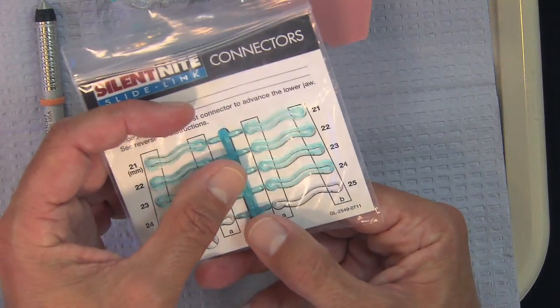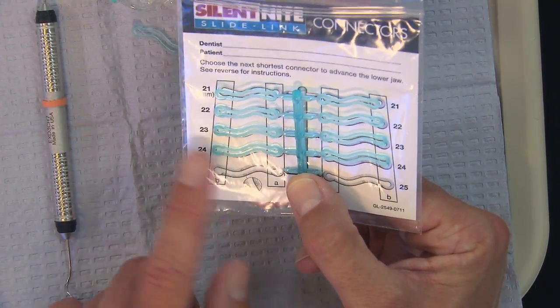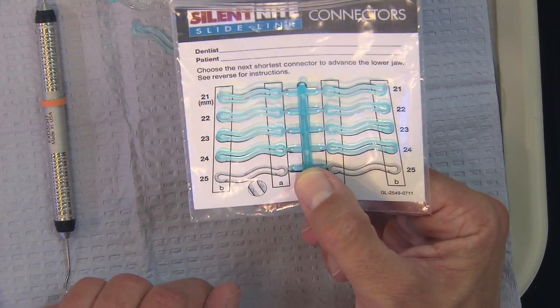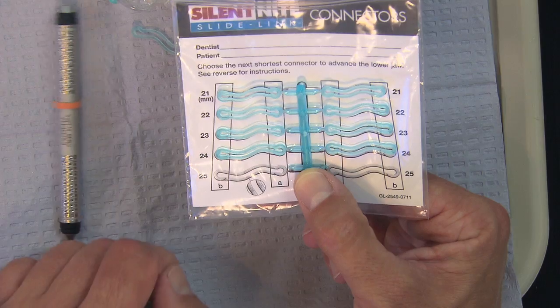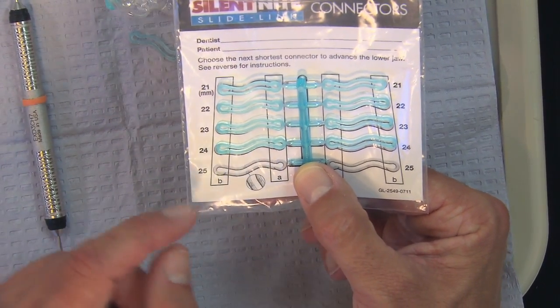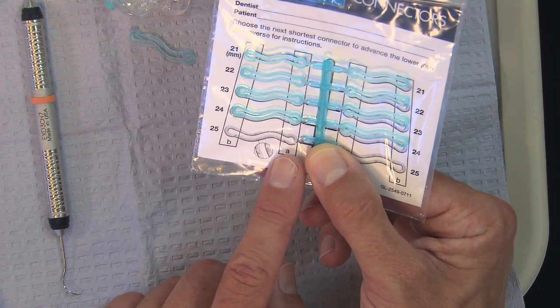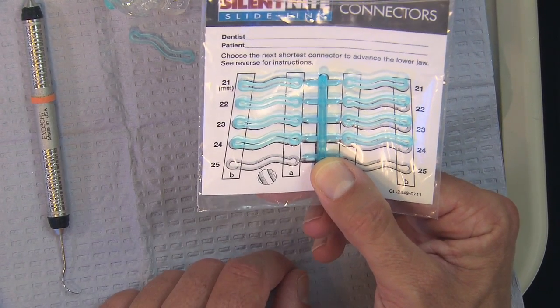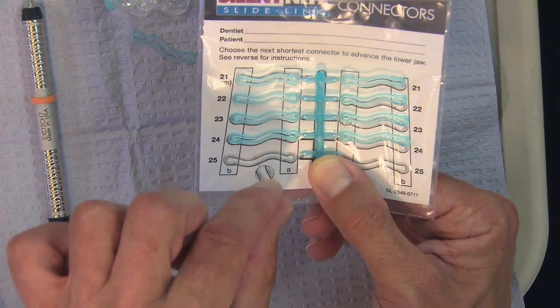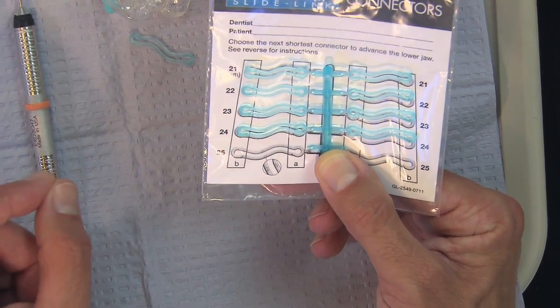And really the only thing you need to pay attention to, you can see when I hold it over the card how the 24 millimeter connector overlays where it's printed on the card, so it's easy to see, but there is a 2 and a 4 printed on the connectors themselves. If one were to come off and wasn't attached anymore, you can still tell which one it is. You can see also that we have an A column and a B column here as well. And the A column is for the upper, and so that's the one that's going to click on and not move, and the B is the one that attaches to the mandible and has some slide to it.